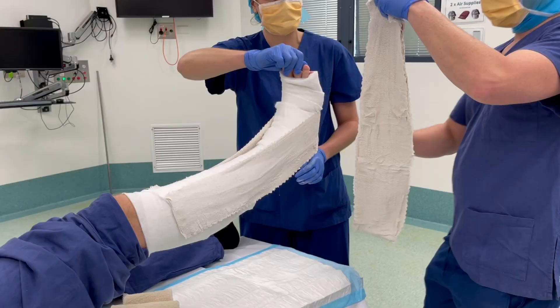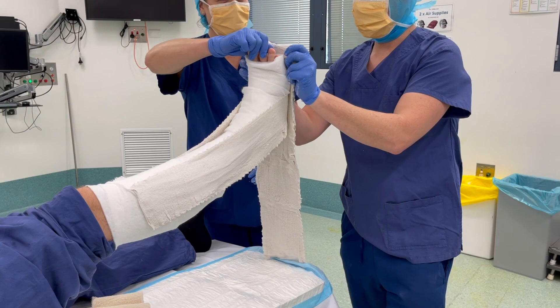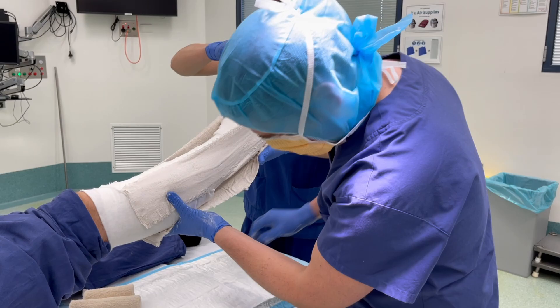We follow this with the application of the back slab, which was prepared earlier, applying from the metatarsal heads distally. It is important to ensure both plasters do not encircle the leg.